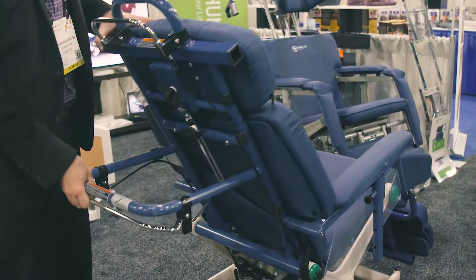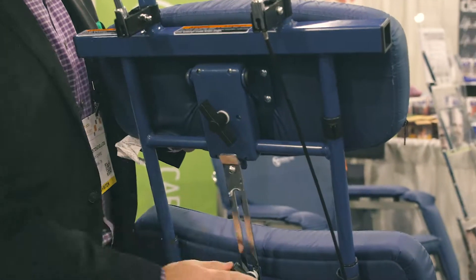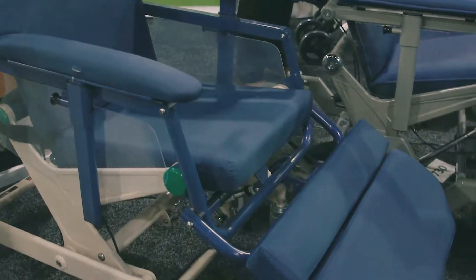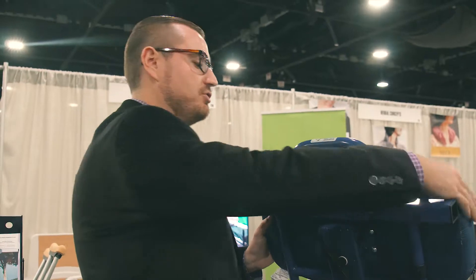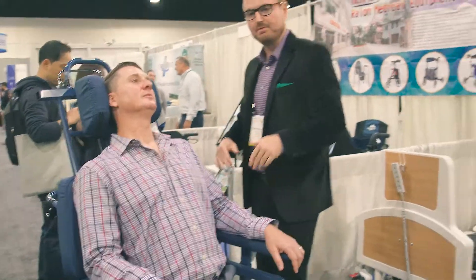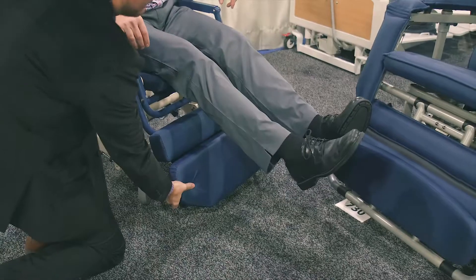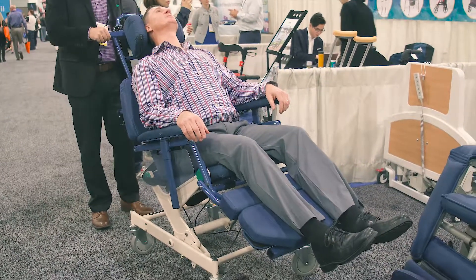You can height-adjust this for a taller patient. Back here you'll see this little knob — there's one on the foot as well. If you loosen that up, you can adjust it for a taller patient. Fully extended, we usually say about 6'6" would be the max capacity. For a patient who is a stroke survivor or someone without great trunk control, you can use this to keep their head centered — one or both sides. You can also adjust the armrests up to meet their needs. The foot plate can come out if you want your foot out, or the leg rest can come up and be adjusted to different positions, and it will come back with you as you bring it back.